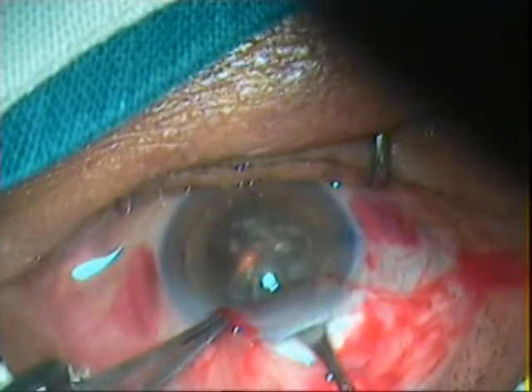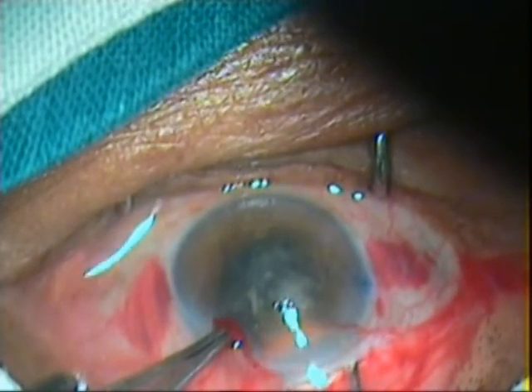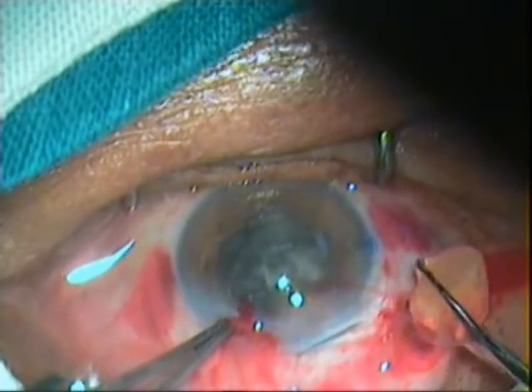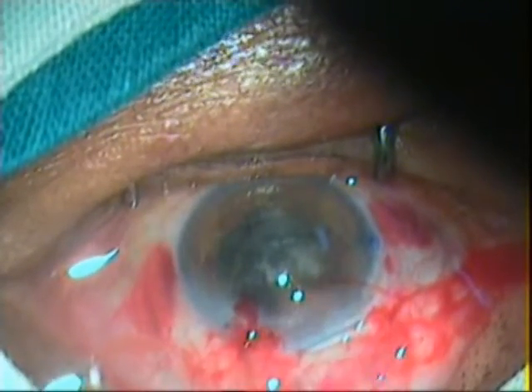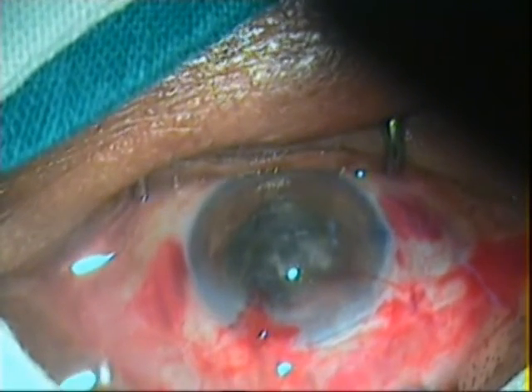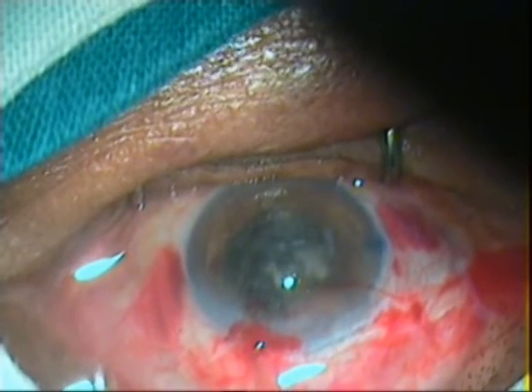The nucleus is engaged in the lens loop and slowly withdrawn from the anterior chamber while the posterior lip of the tunnel is depressed. Once the nucleus is engaged in the tunnel, the Lewis lens loop is pulled posteriorly and upwards. This causes breaking and removal of one part of the nucleus, while the other part remains engaged in the tunnel.